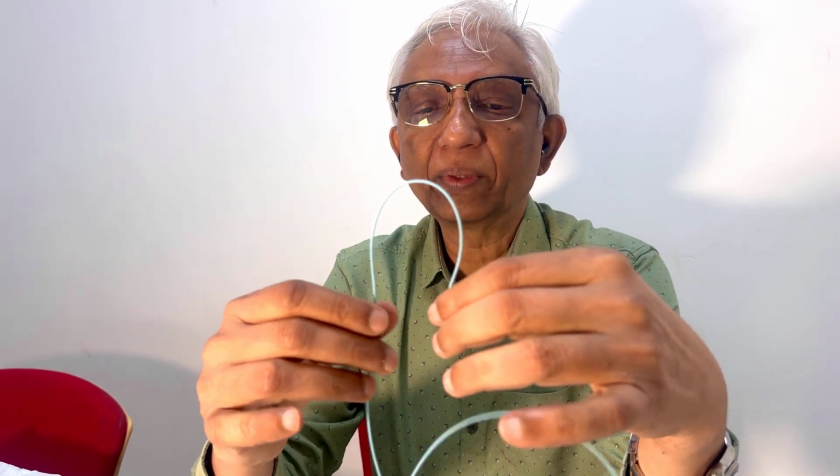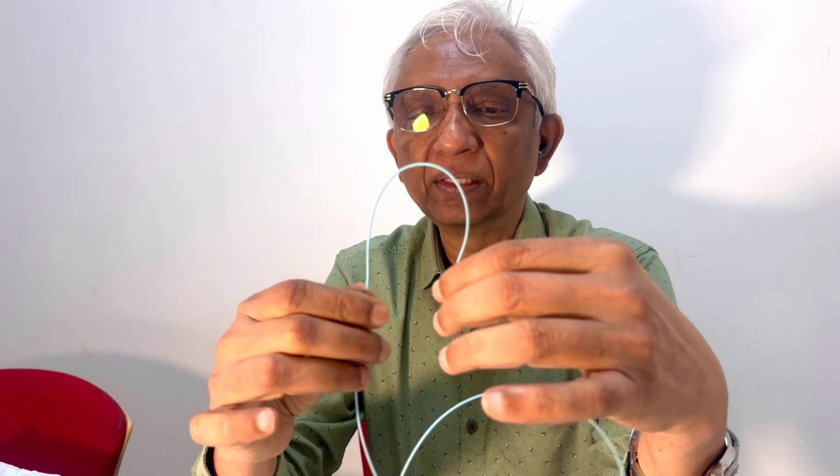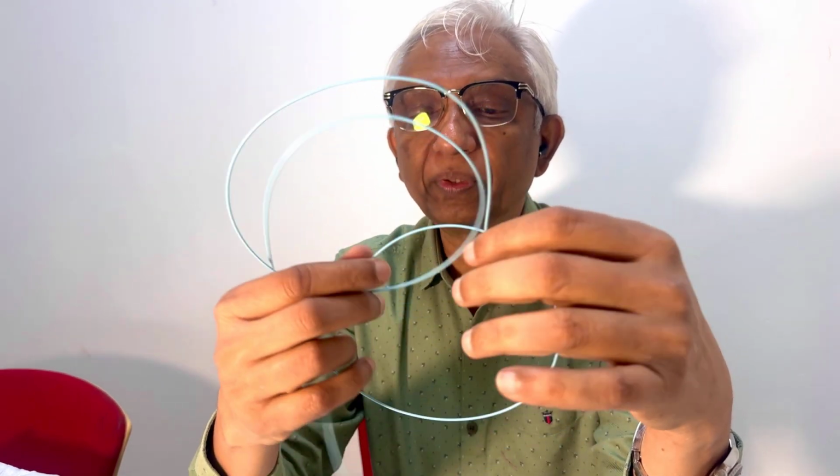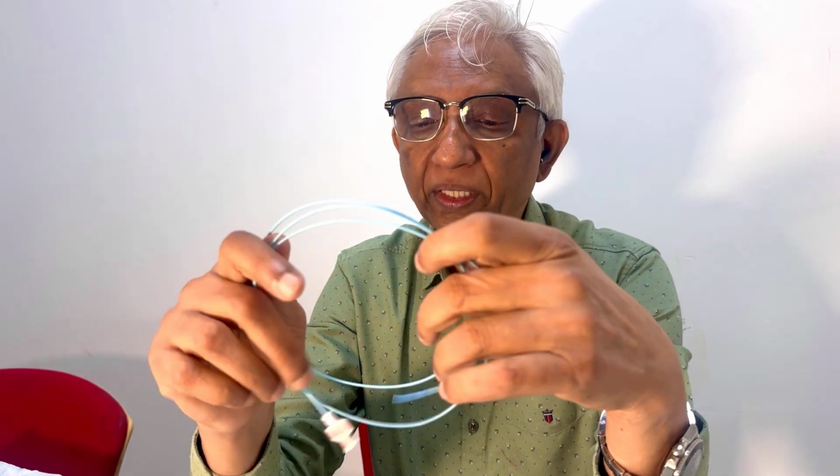Try to pull it down, get into a renal artery or get into a branch. Then start slowly, carefully under multiple mags. Keep looking till the catheter unfolds itself, and then you can pull it out. But this is only possible with a braided catheter. All the other catheters will break. I'll come to that, okay?